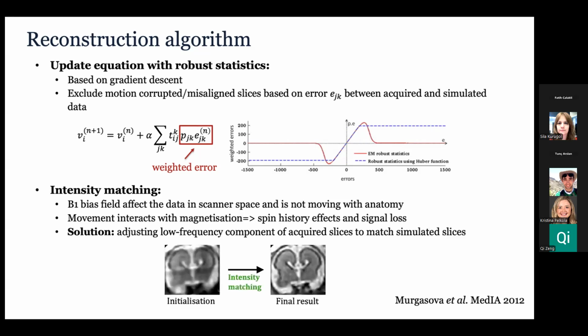And I don't have the equations here, but basically it works by adjusting the low frequency component, because we assume that these intensity changes happen with very low frequency. That way we can disentangle it from the anatomy.